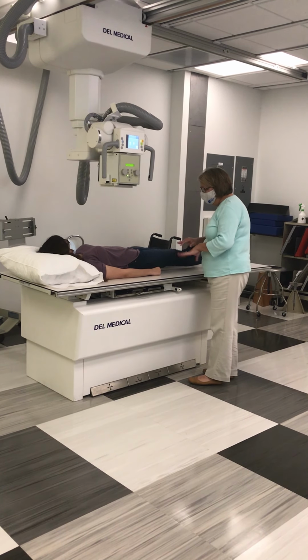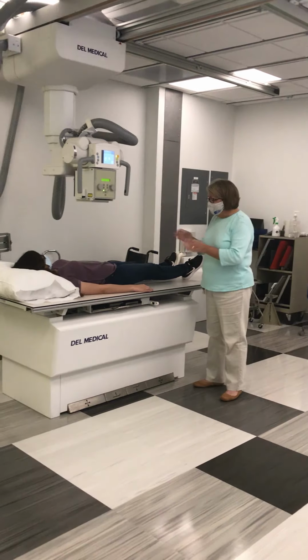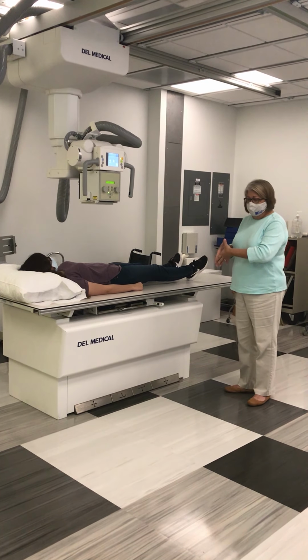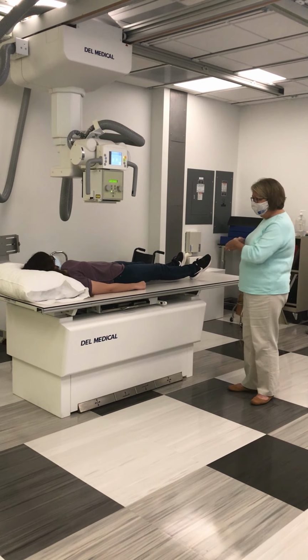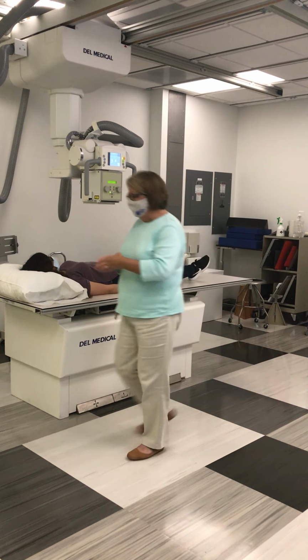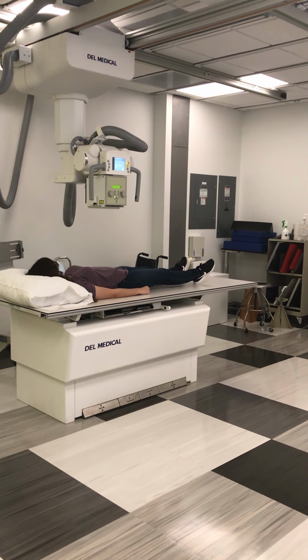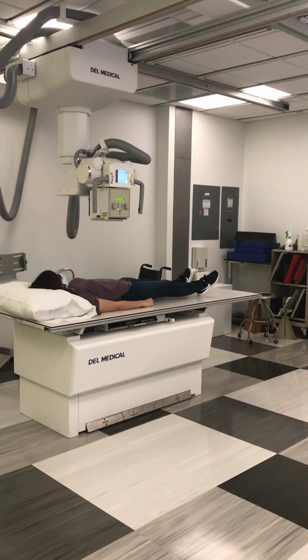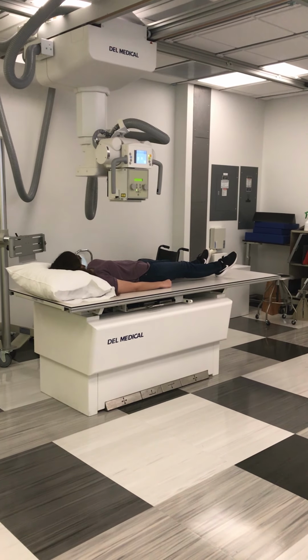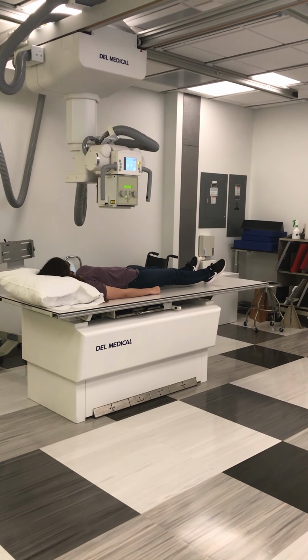I want you to move your arms a little bit away from your body. Thank you. So you abduct the arm slightly. Shielding is not required. Now I'm going to give my patient breathing instructions. Ma'am, please take in a deep breath. Blow it all the way out. Hold it out. Don't breathe. Exposure. You may breathe and relax.